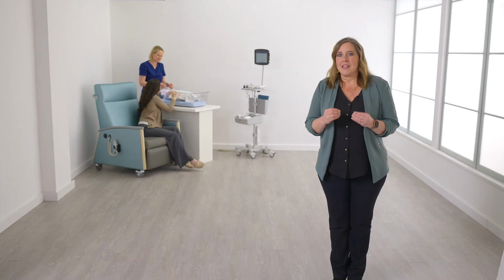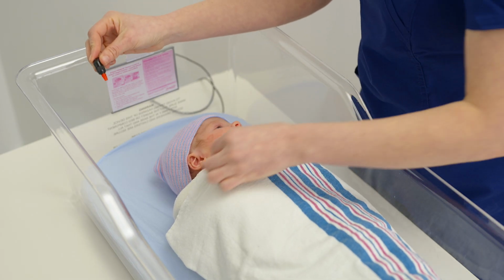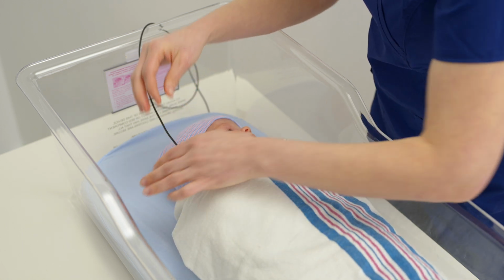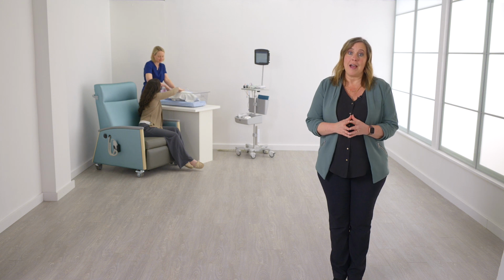For OAE testing, the probe must be securely inserted into the baby's ear canal. Massage the front of the ear canal and pull down and out on the outer ear to pop open the ear canal. Select the appropriately sized ear tip. If there is visible debris or fluid blocking the ear canal opening, it may be best to wait a few hours for the ears to dry out and then retry.